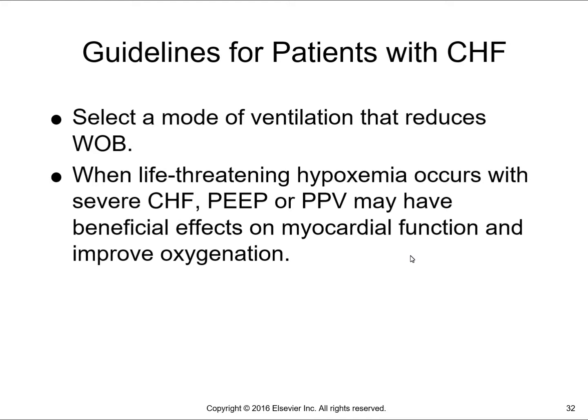So if I have left-sided heart failure, the left side of the heart can't pump blood to the aorta to the rest of the body, so it gets backed up into the lungs. So we're going to be dealing with left-sided heart failure, okay, and so that's where we get that pulmonary edema. All right, so we want to make sure that we find a mode that's decreasing work of breathing. So definitely we're going to want PEEP with our CHFers. Right, we want to make sure we push that fluid out of the lungs. All right, so again, when life-threatening hypoxia occurs with severe CHF, PEEP or positive pressure ventilation may have beneficial effects.